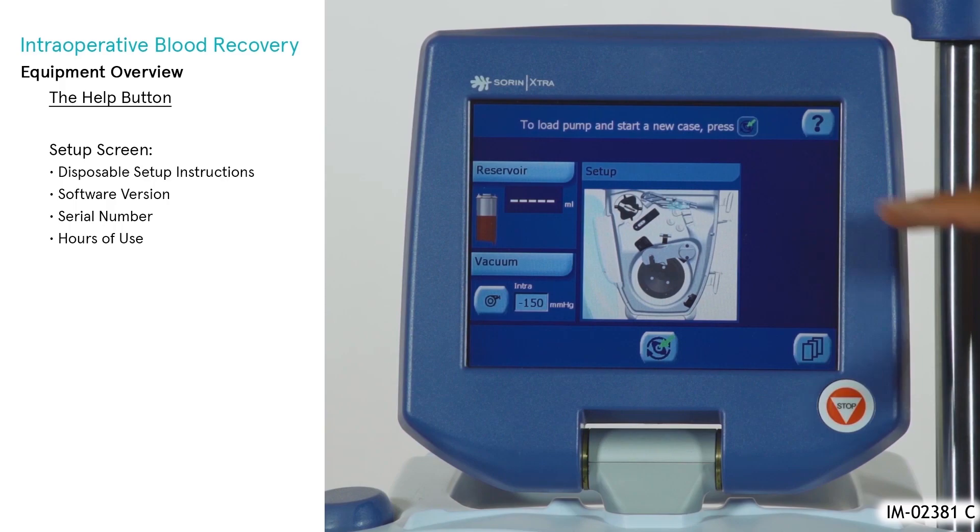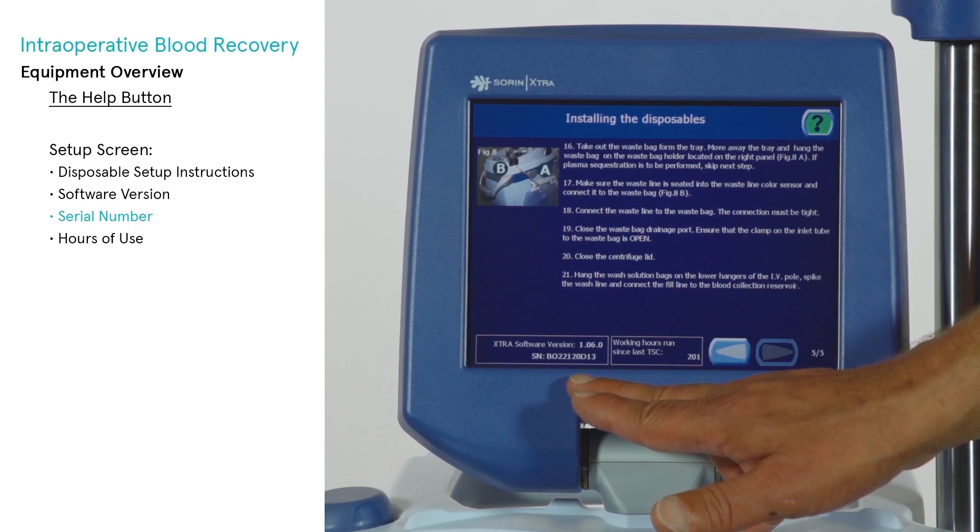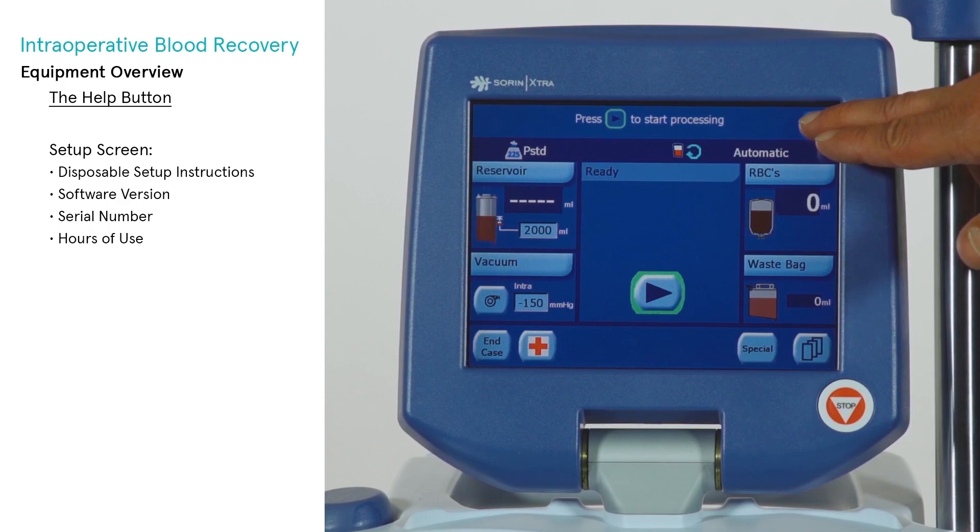The Help screen is displayed by touching the Help button from any screen. From the Setup screen, the button displays disposable setup instructions, the software version, serial number, and hours of use. From any other screen, the button contains pertinent troubleshooting help. Touching the Help button from any screen will display troubleshooting information about the current warning or alarm.